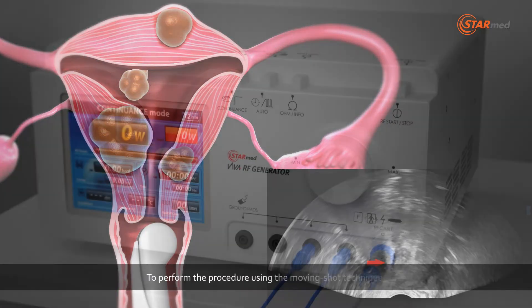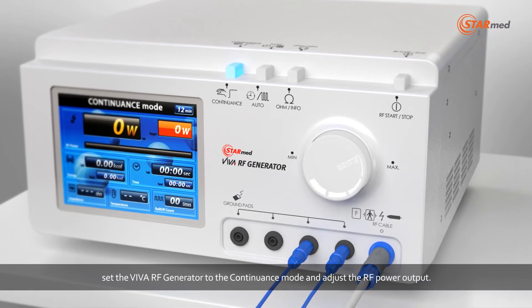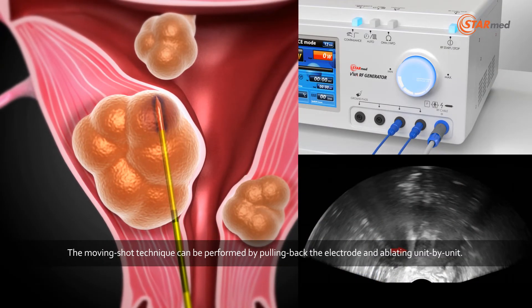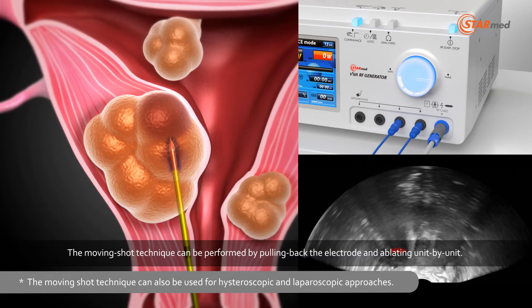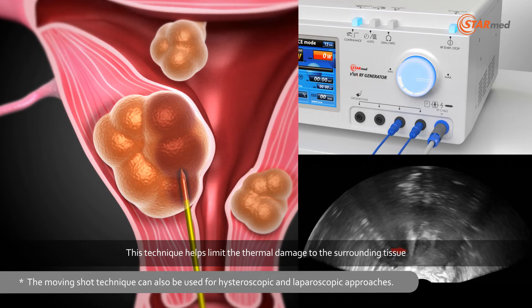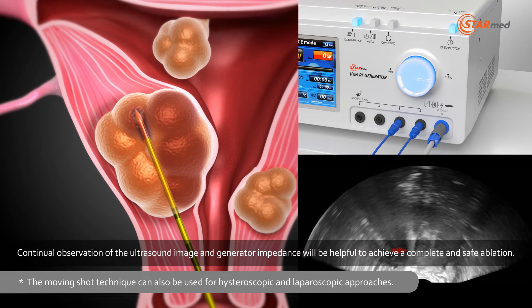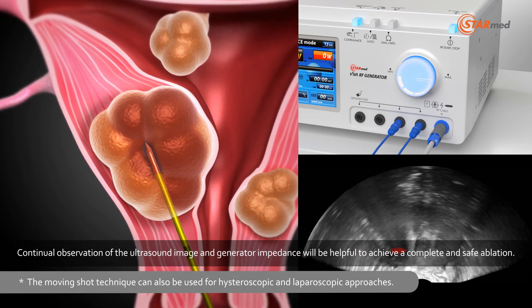To perform the procedure using the moving shot technique, set the Viva RF generator to the continuance mode and adjust the RF power output. The moving shot technique can be performed by pulling back the electrode and ablating unit by unit. This technique helps limit the thermal damage to the surrounding tissue. Continual observation of the ultrasound image and generator impedance will be helpful to achieve a complete and safe ablation.